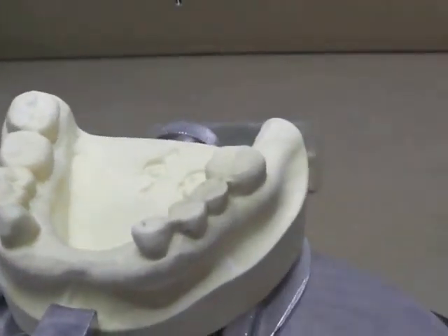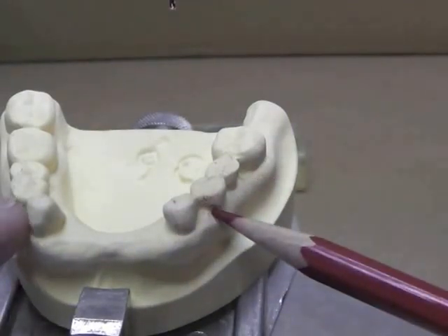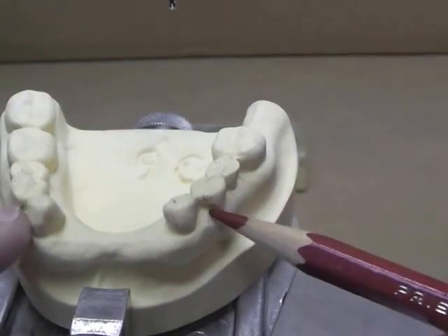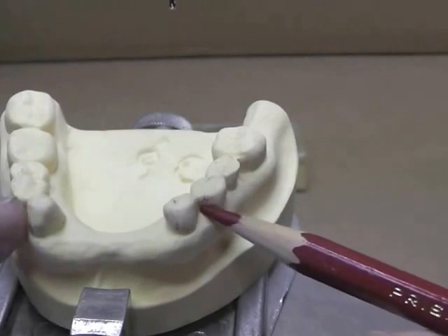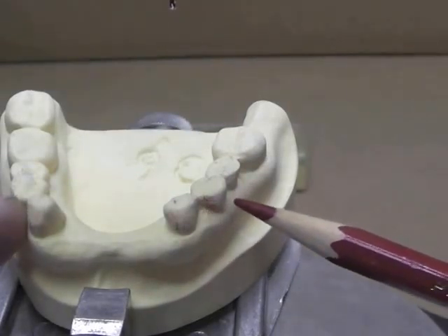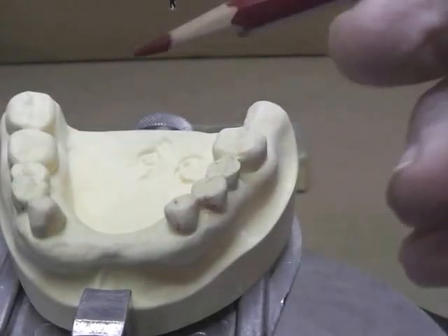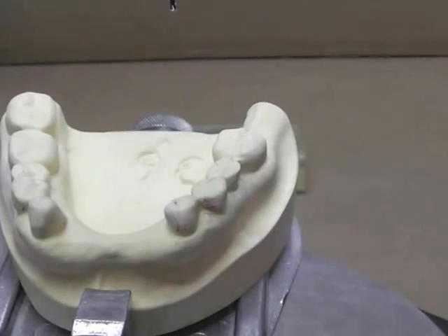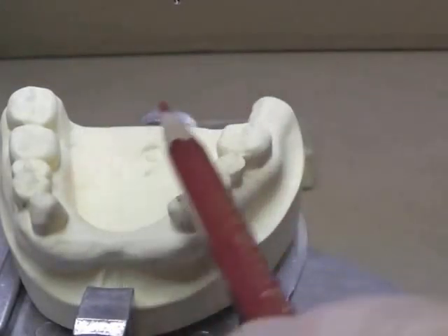I have two options: I can clasp my canines or I can clasp my first premolars. I kind of like the first premolar because it's a little more aesthetic. I have a buccal and a buccal undercut, so I've satisfied my need for balanced retention. These posterior molars can have one on the buccal and one on the lingual, or two on the lingual — I think two on the lingual would be more balanced. The only thing I cannot have is buccal and buccal combined with lingual and lingual, or my partial denture would want to dislodge in that direction.